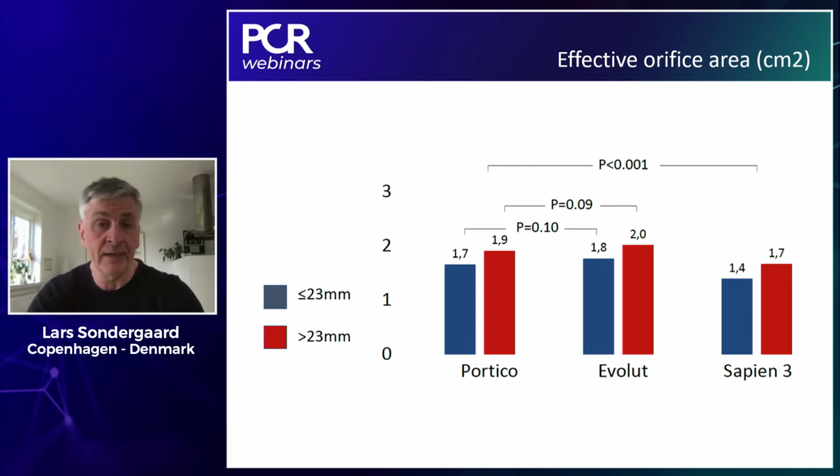Again, it has to be in the absence of coronary disease, because the risk of developing something over the course of her lifetime is going to be very small, probably in the single digits. And if we can attain commissural alignment, I think that would be okay.